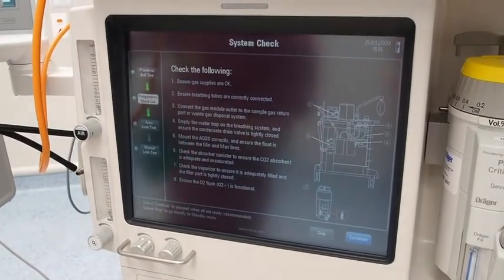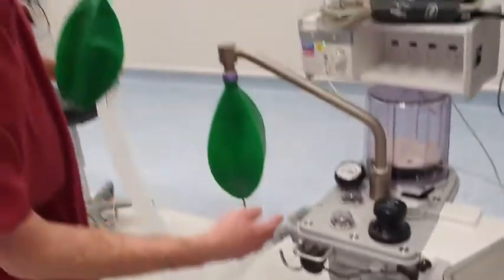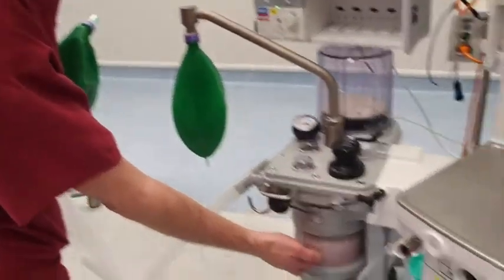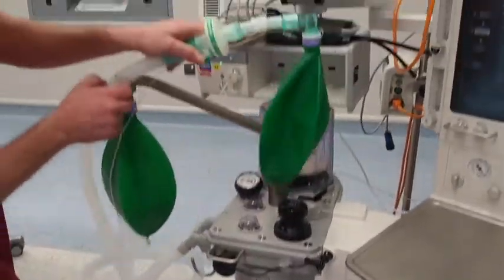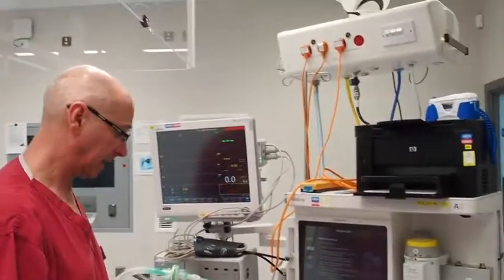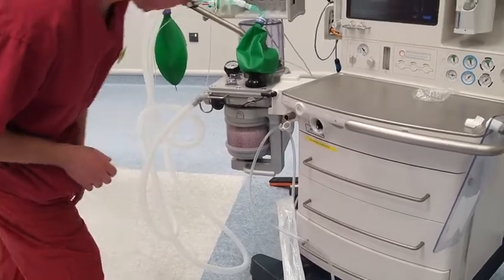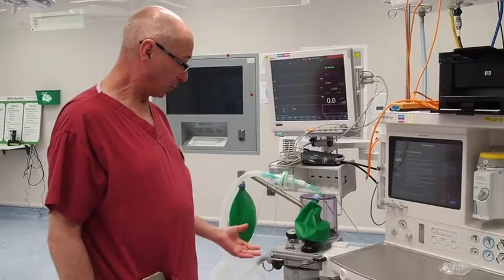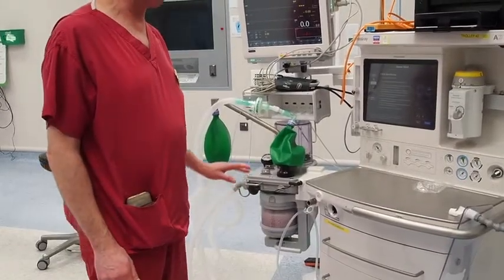This is a circle system where the gases go round, come out, go round in the patient, come back again, and the CO2 is removed by soda lime, which uses a chemical reaction to take the CO2 away, and this allows us to use much lower gas flows in these machines than you would do normally. So you want to check that the soda lime is the correct colour. I think you can safely make the assumption that this will be fresh when we come to it, because all these machines will be prepped.